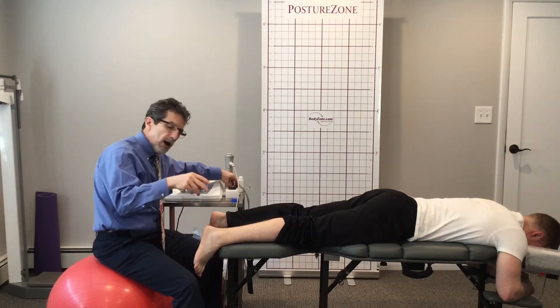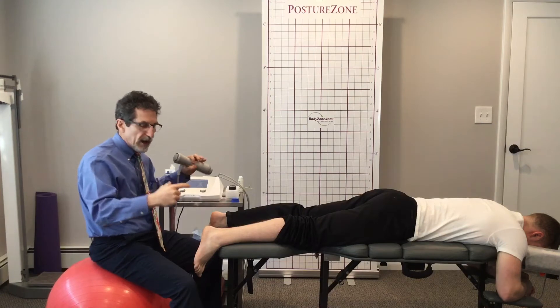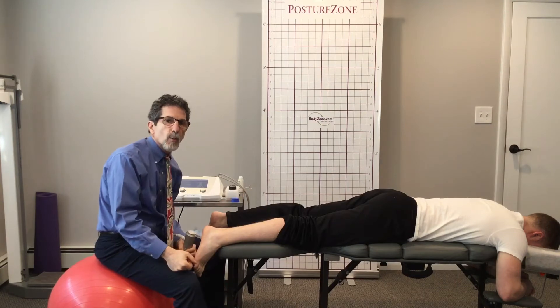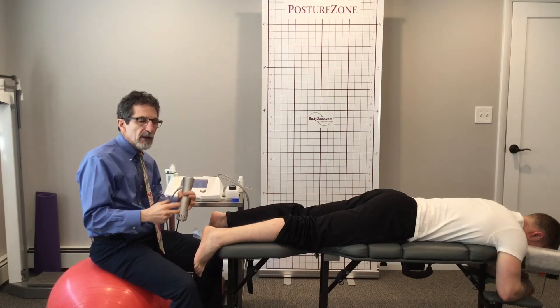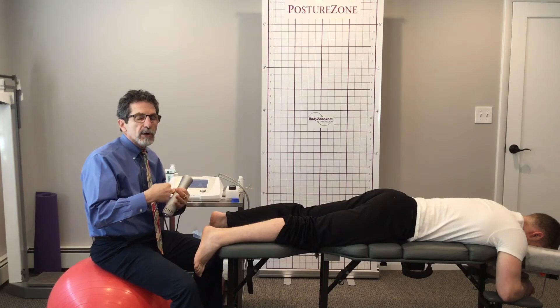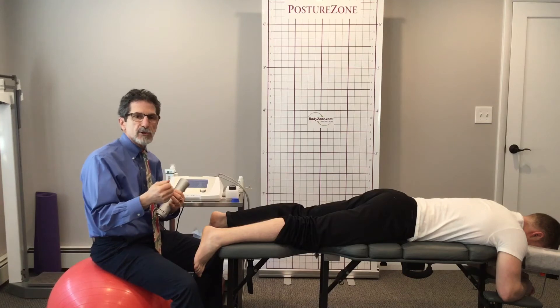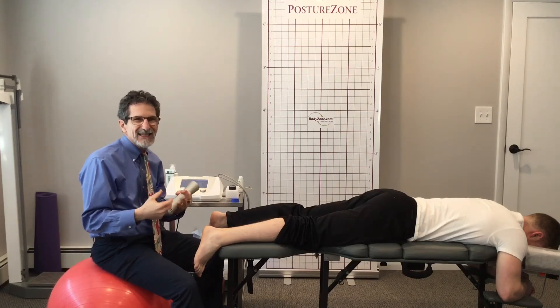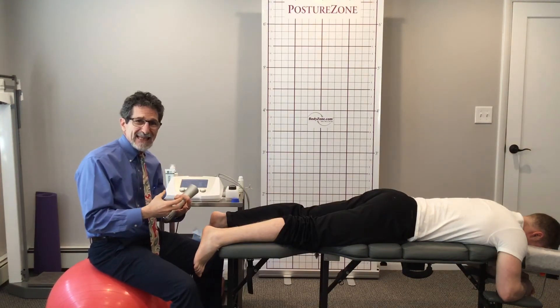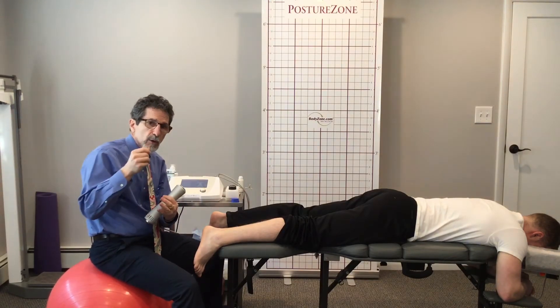Radial shockwave therapy is like dropping pebbles in a pool and it creates radial waves — a waveform of pressure. Muscles are 73% water, so by creating that waveform it helps drive nutrients into the area. As you get closer to areas where the tissues are not healthy, where there's a breakdown in the tissue, scarring, or what we call tendinosis — a fraying from the inside — or in the plantar fascia where it's thickened and the fibers are no longer in the proper direction and are mismatched, you want to go right over that area.